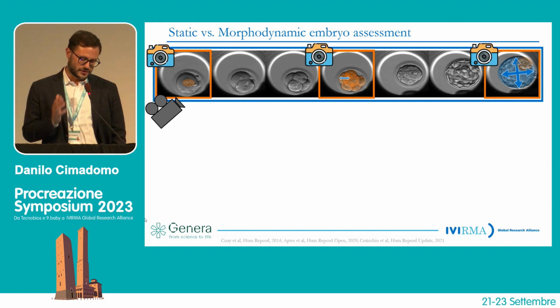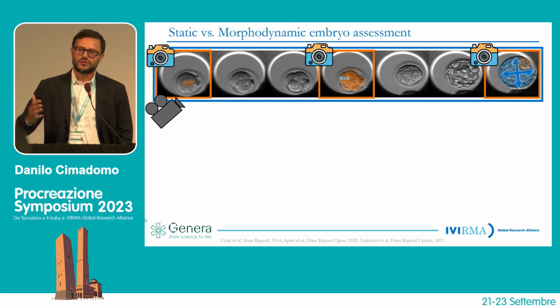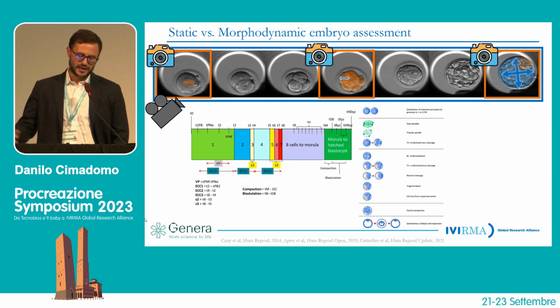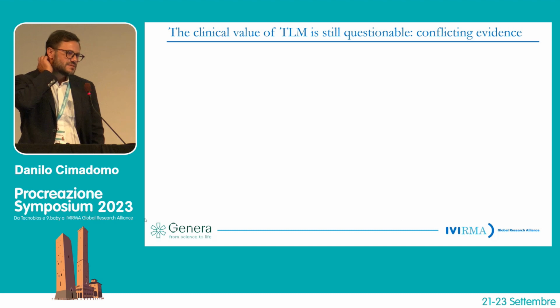The introduction of time-lapse basically gave us the possibility to have an observation that is not based just on little frames of this whole video, but we have a continuous observation. This means that we can make morphodynamic assessments, we can look at all the different timings and divisions, as well as we can spot abnormal cleavage patterns, as well as abnormal events such as collapse that are otherwise impossible to be analyzed.